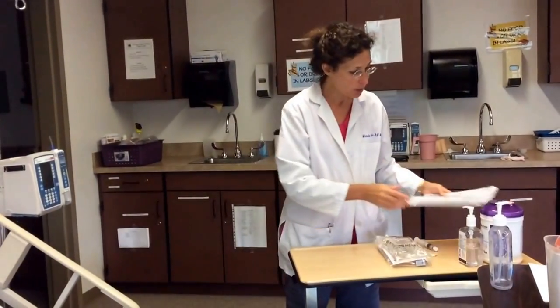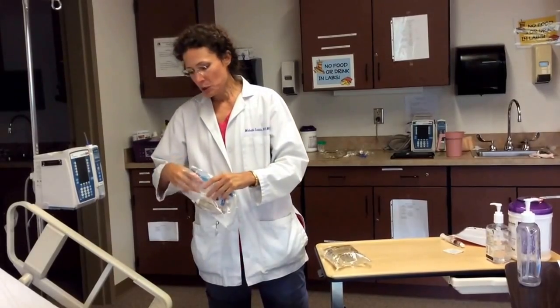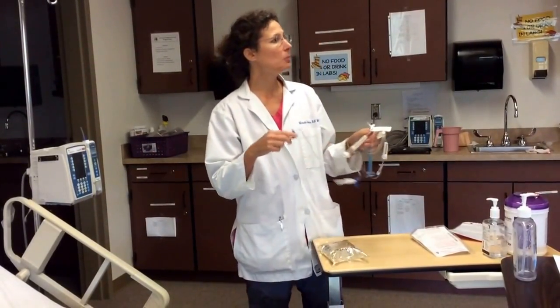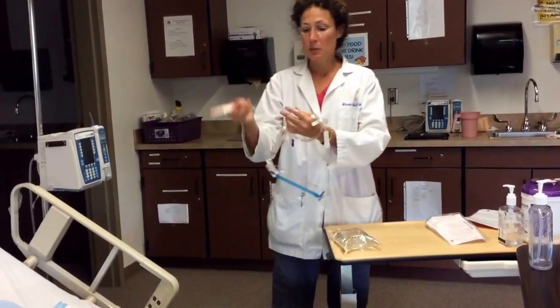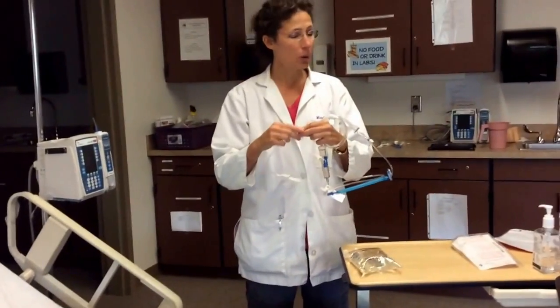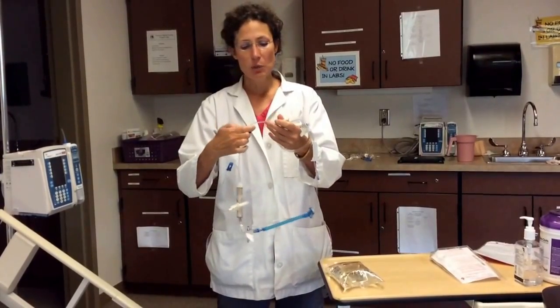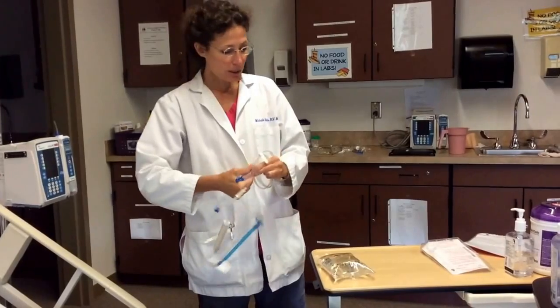So at this point, after that assessment, I'm going to prime the blood tubing. Blood tubing is good for 4 hours from the time we start the transfusion, and the unit of blood as well. We don't want it to hang for longer than 4 hours. So the first thing I do when I take any tubing out of the package is close all my clamps. Understanding what needs to be open when is important during a blood transfusion. So I'm going to just close everything.